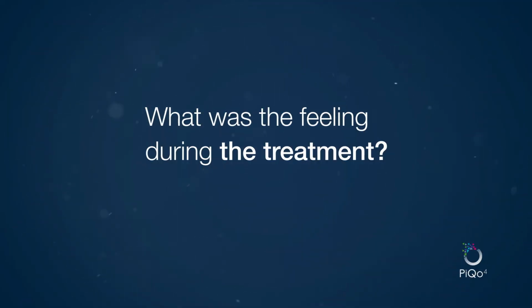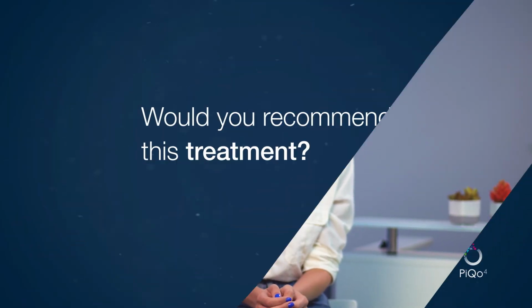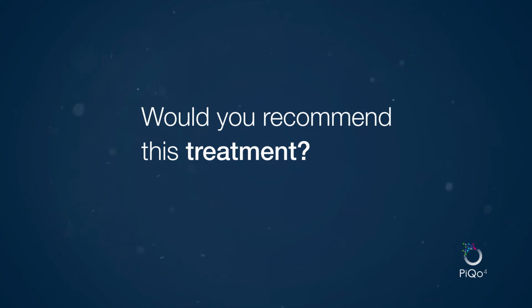The condition I came to treat was slight skin toning and a little bit of pigmentation. During the treatment, I thought it would be painful, but it wasn't at all. I felt a little tingling, and that's it. After the treatment, my skin felt a bit reddish, but it passed within a few hours. I would really recommend this treatment to others. I was a bit scared at the beginning, but it was really quick and painless, and I already feel a difference.